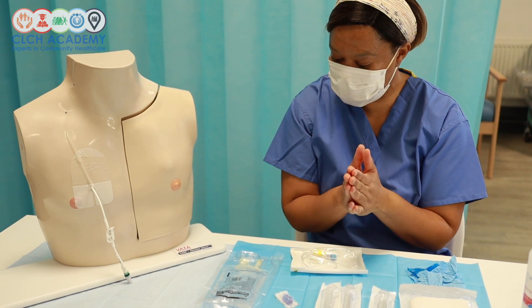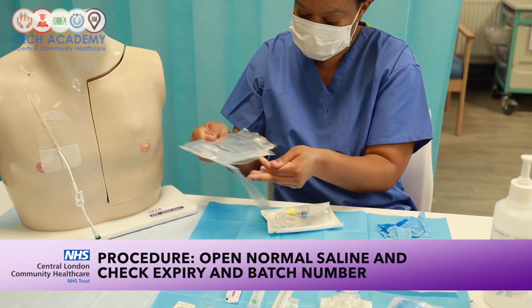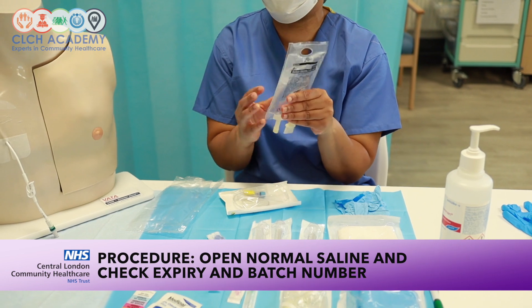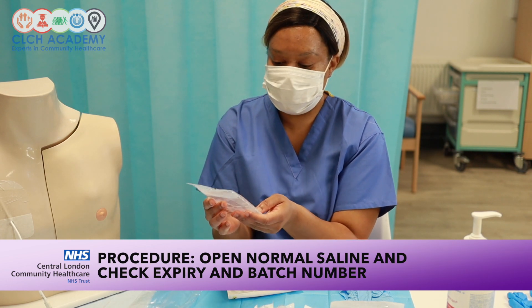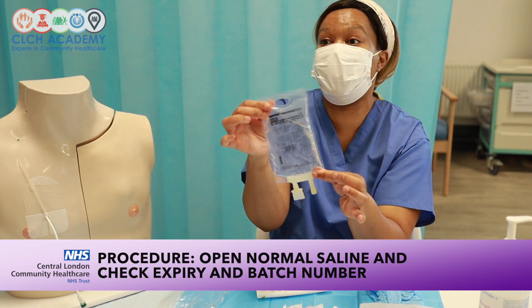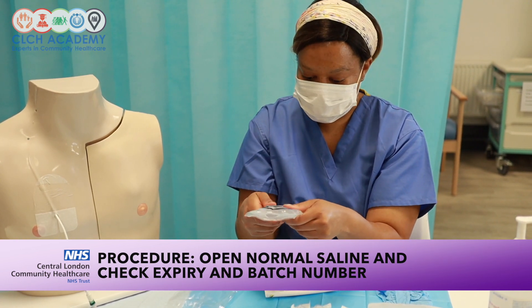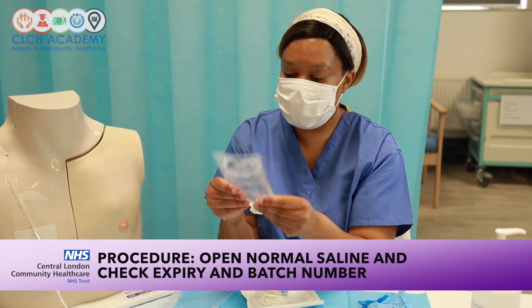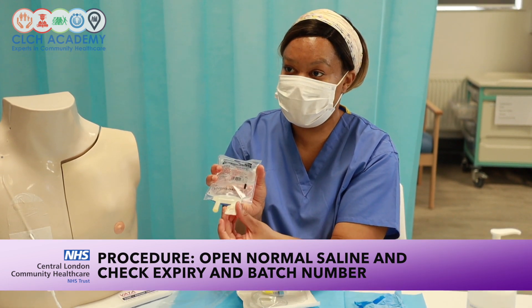First I'm going to open up the normal saline. Key steps: check it's in date — this bag is 2021, 100ml normal saline — check the batch number, check for no particulates within the bag, squeeze it to confirm no leaks or punctures. It shouldn't be cloudy with precipitate or contain any foreign bodies. It should be clear, with a sealed cap demonstrating it hasn't been tampered with.